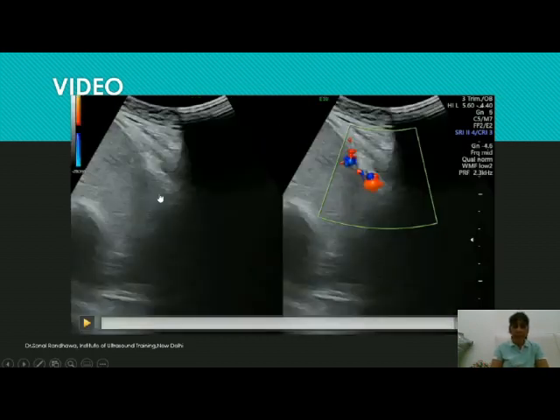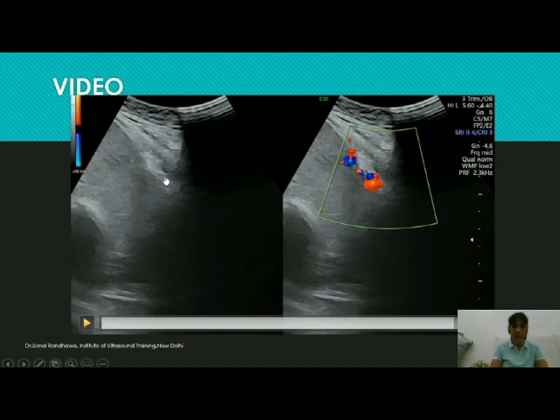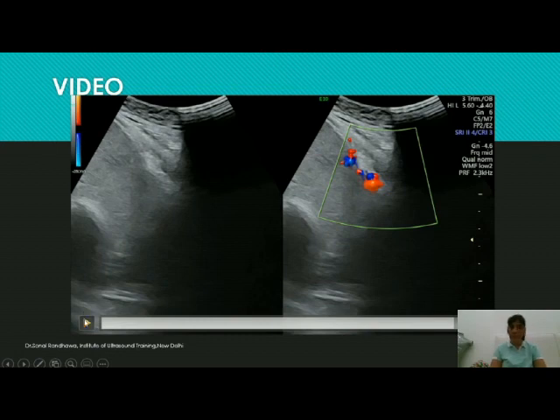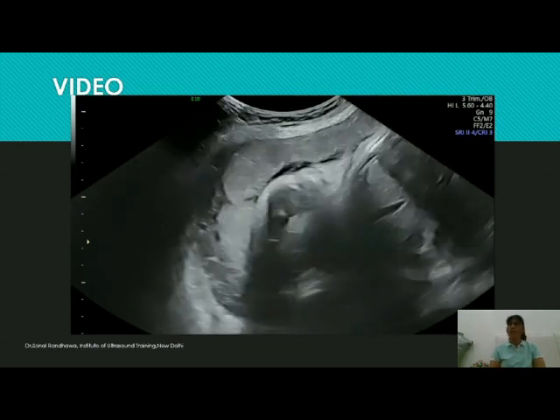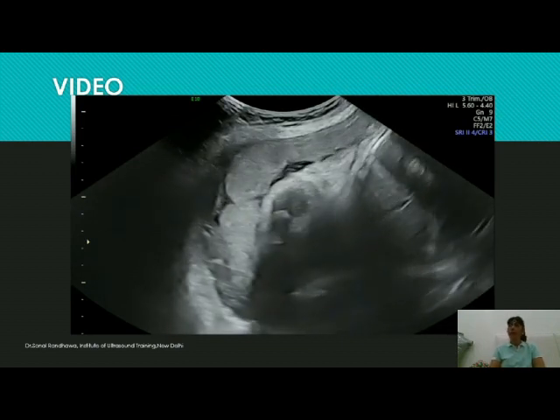Moving further in the same patient, the whole serosal layer has become irregular and hazy in this portion. You can see the serosa clearly up to a point, and then in another portion it has become very irregular — and in that same area the color flow has also increased.